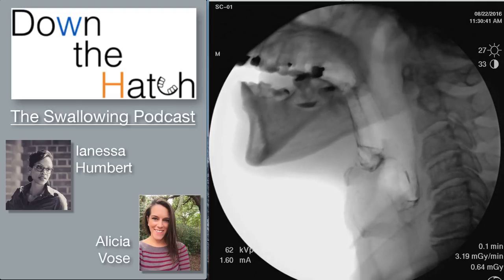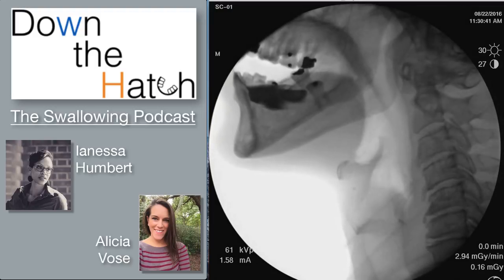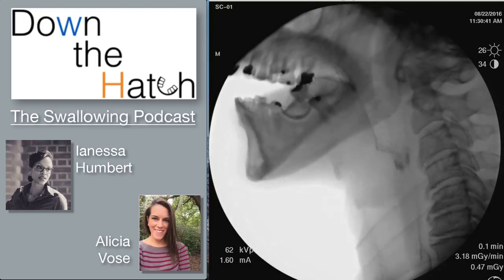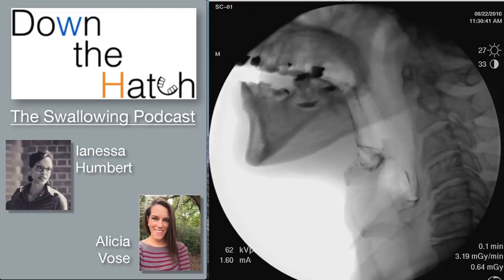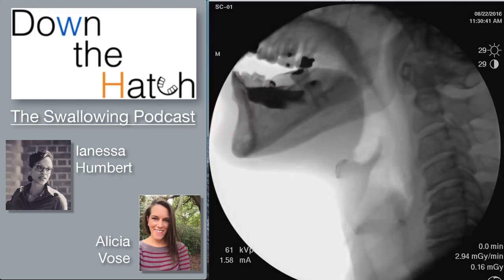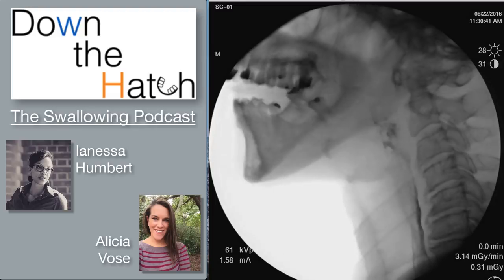Airway protection would you say is pretty normal — yes, agreed. What about bolus efficiency? I would say it's functional — the job is done. A healthy younger person with no swallowing history would probably get that cleanly down in one gulp. This is likely an older person based on the vertebrae and dentition, and older adults sometimes need a couple more swallows to clear the bolus. They get that little bit of residue left on the tongue and scoop it up, and some of it falls back prematurely, but I wouldn't consider that abnormal.